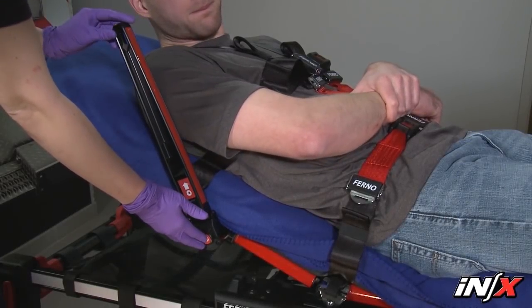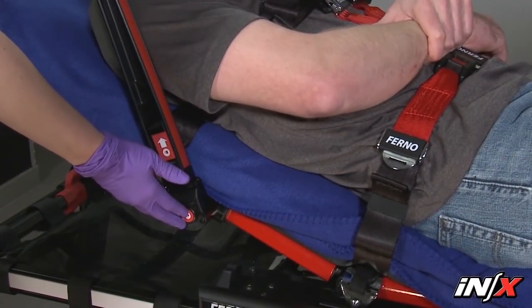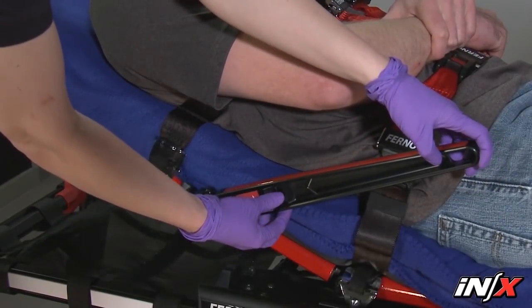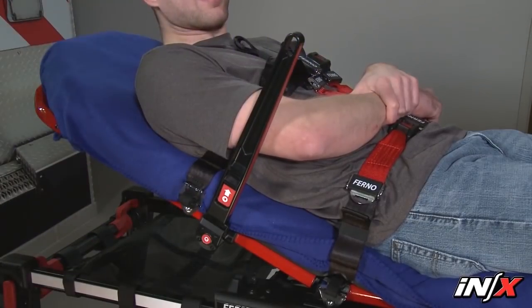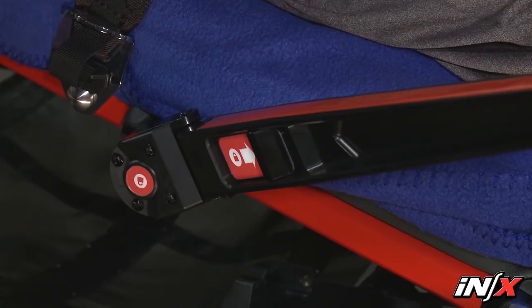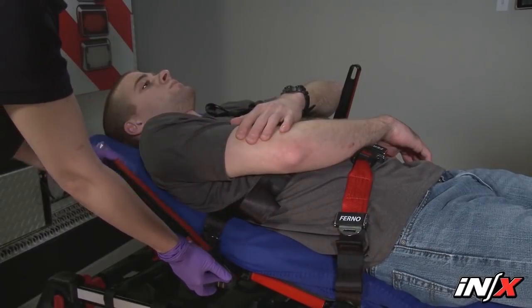The sidearms provide patient security and comfort. They're attached to the backrest and move with it when the backrest is adjusted. To rotate a sidearm, push the round red button in the center of the sidearm mount casting and rotate the sidearm to a new position. Locking positions are at approximately 45-degree intervals. The sidearms also have a wide position, useful for a large patient or for starting IV lines. To swing the sidearms outward, slide the release lever away from the mount casting to unlock the sidearm and swing it away from the patient's surface. Push the sidearm toward the center of the NX to engage the lock in the inline position. The storage position is rotated toward the loading end of the NX, aligned with the backrest.